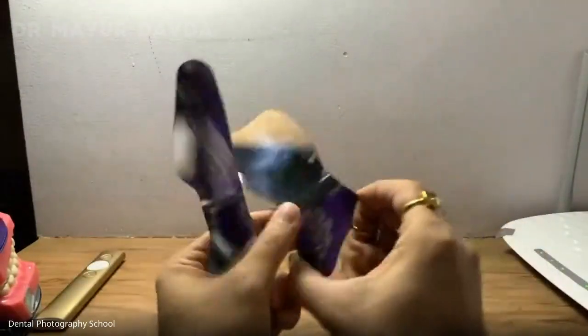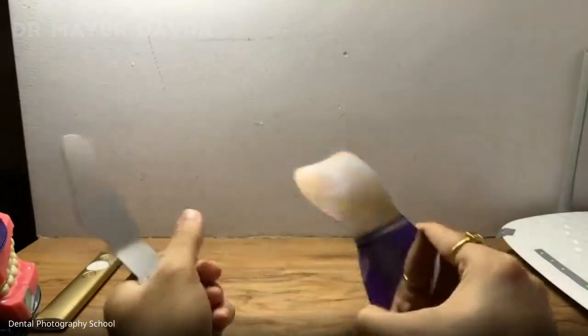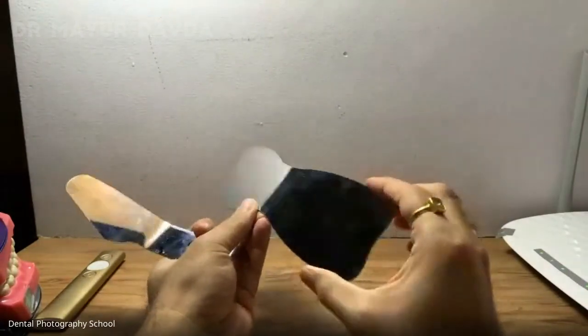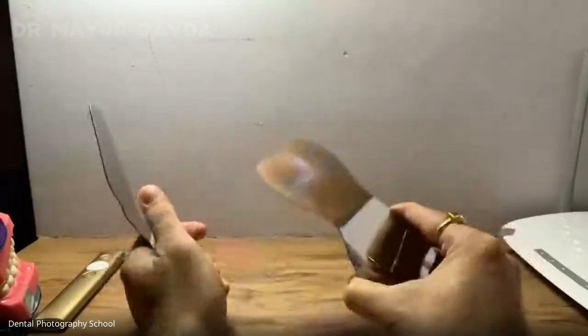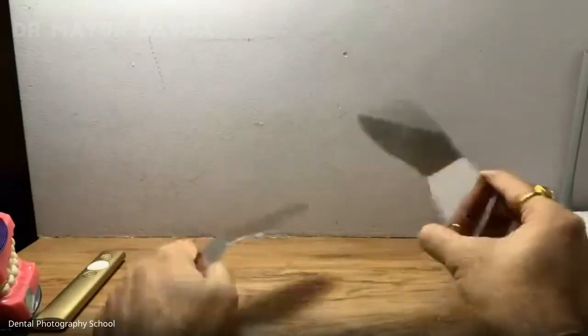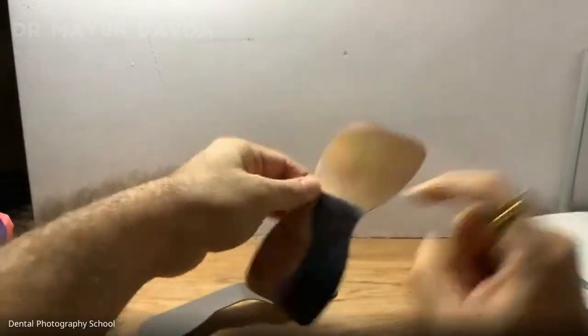Don't keep on trying to put these mirrors inside the patient's mouth, because you require a very good opening for this. This is an adult full arch occlusal mirror, and this is a pediatric full arch occlusal mirror. If you don't want to record a full arch picture of the patient, don't use these mirrors. And keep in mind, we never use the concave side.